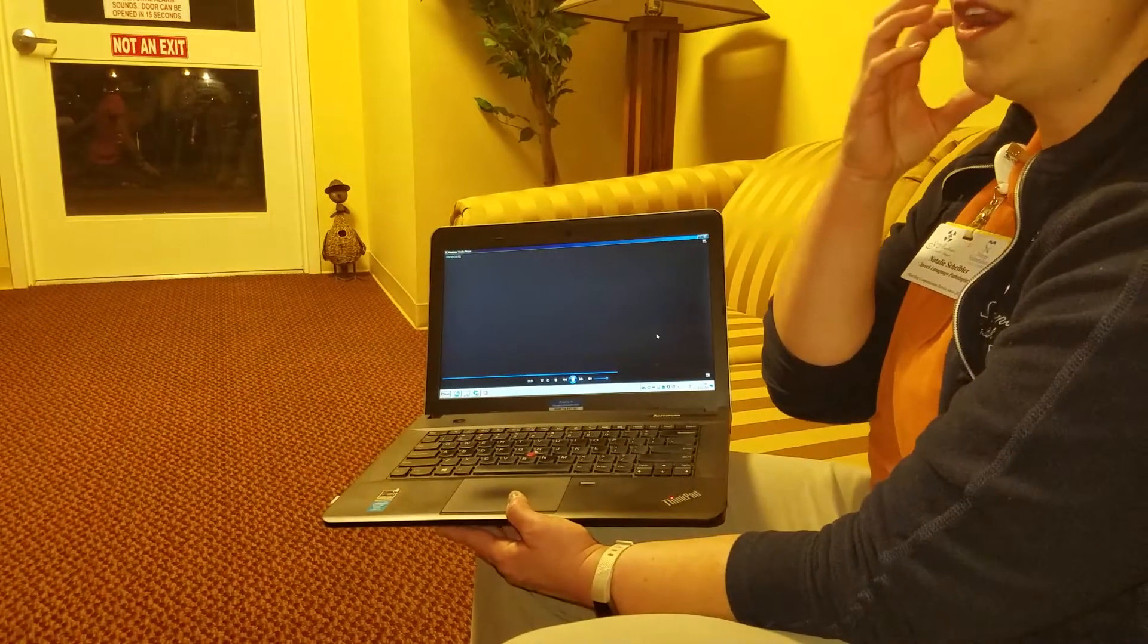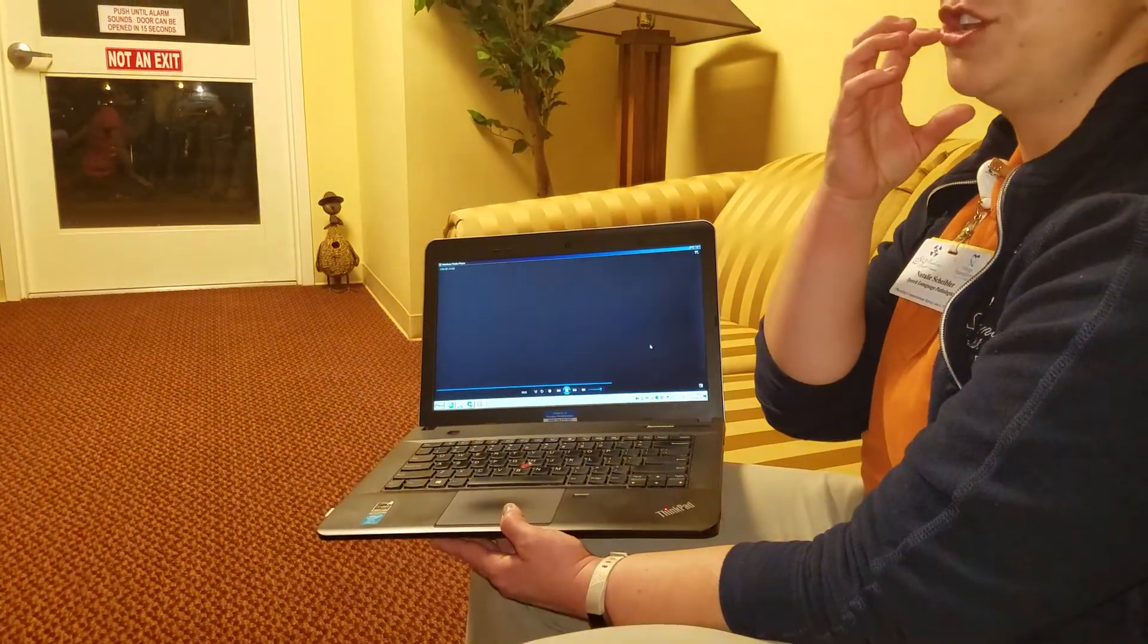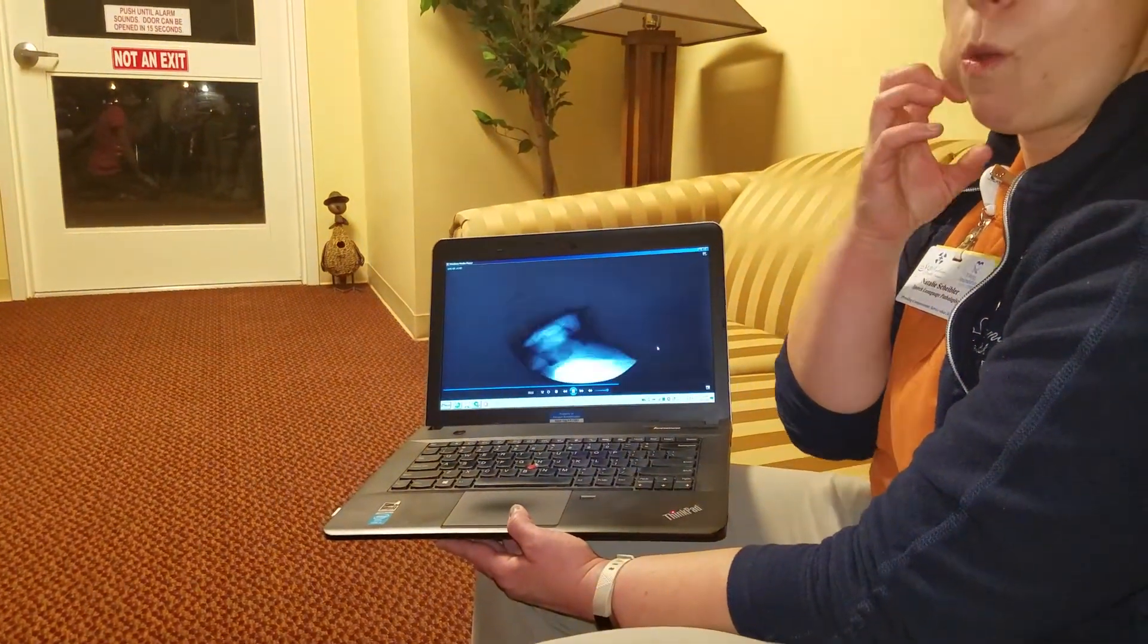So the next bite we went to the strong side. We went to the left side and presented it on the left side so he could work it strong side first then move it over. That's something we'll work on too.